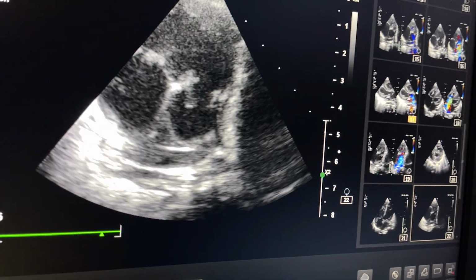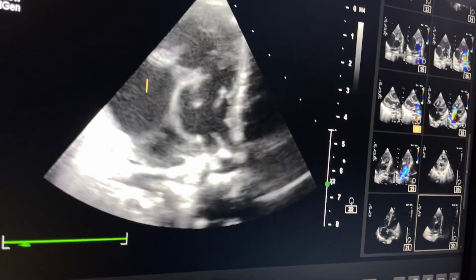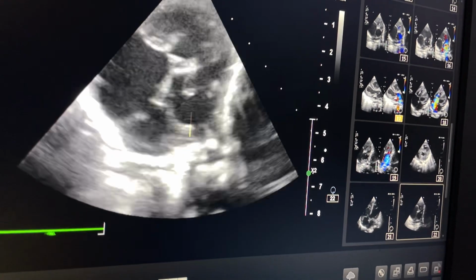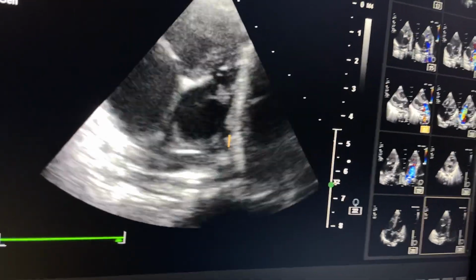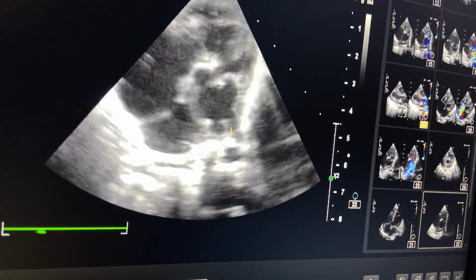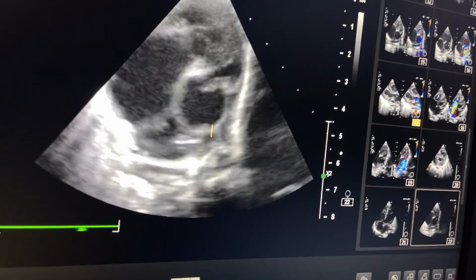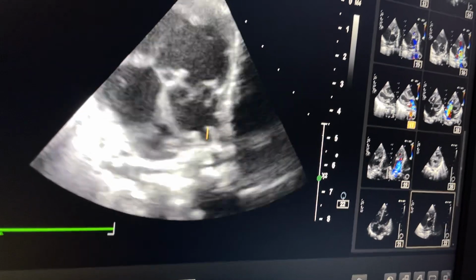Again you see this is right atrium, this is right ventricle, and this is truncus, and this is right pulmonary artery branch, this is left pulmonary artery branch. So whenever you see only one great artery coming from both ventricles, and you try to find right and left pulmonary artery branches or main pulmonary artery branch, if you get that, then that is always the case of truncus arteriosus.